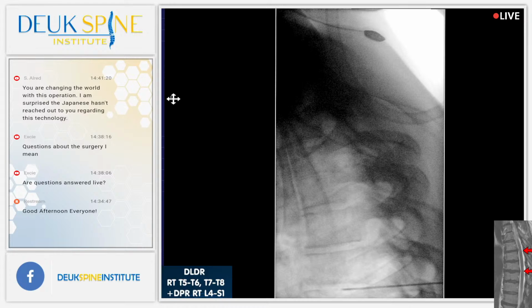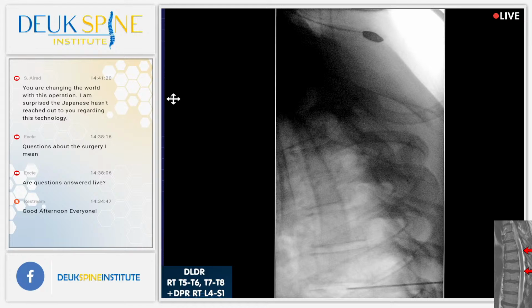The reason why, and this is the most challenging part of the surgery, is this. I think it looks better, right? Yeah. So what we're doing, folks, is we have to have reliable navigational information. And since we're using this X-ray machine to navigate to the area we need to be in, we must make sure it's reliable.